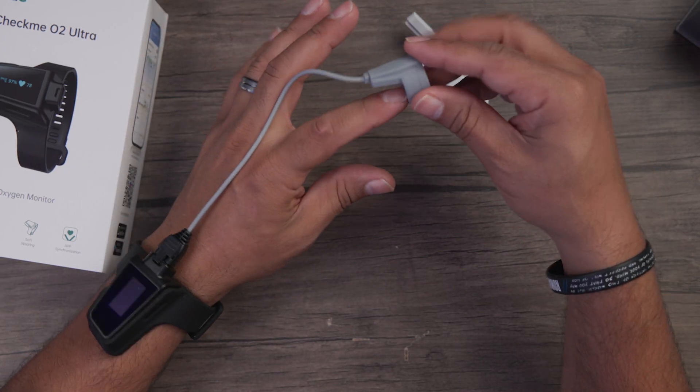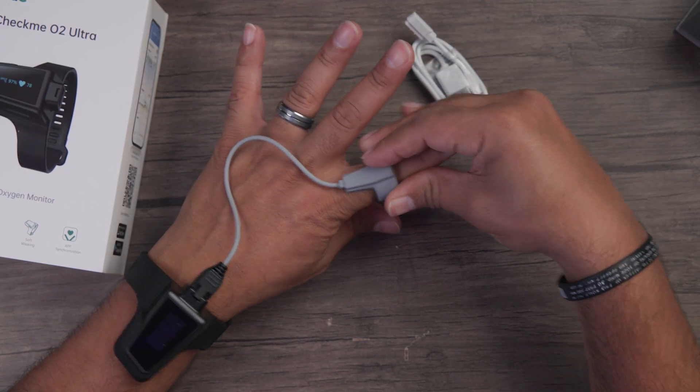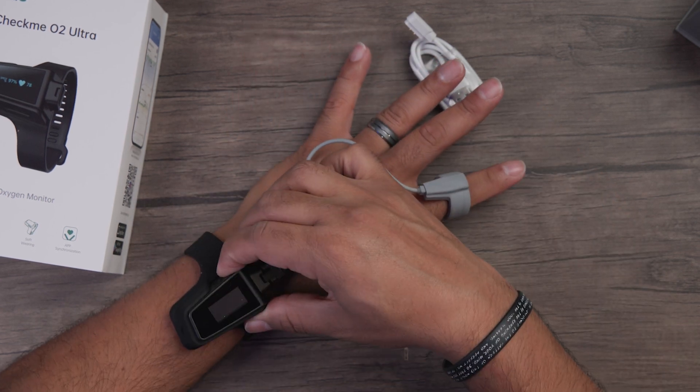To set this up, go ahead and put it on your wrist like a watch. Strap it on, tighten it up, and push it into the grooves of the wrist. Then take the finger sensor and put it on your index finger, and go ahead and turn on the power button.